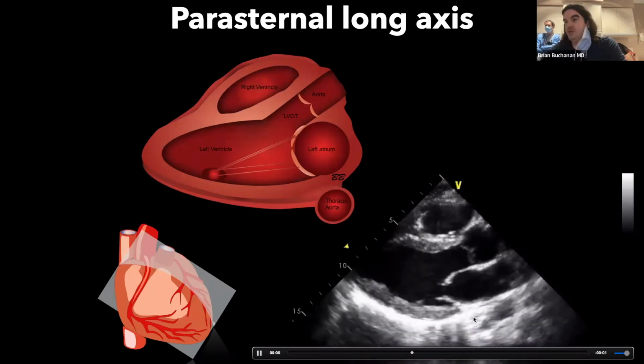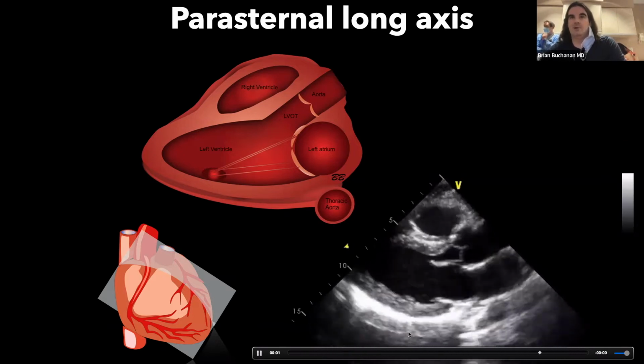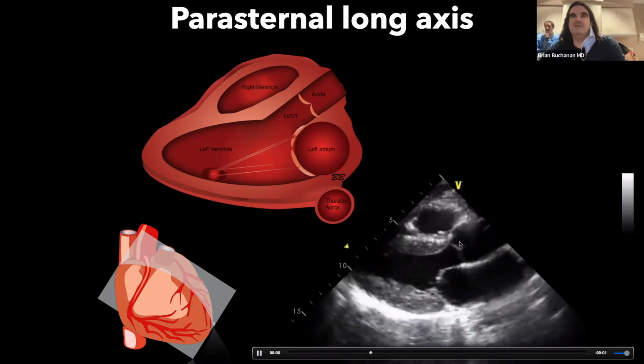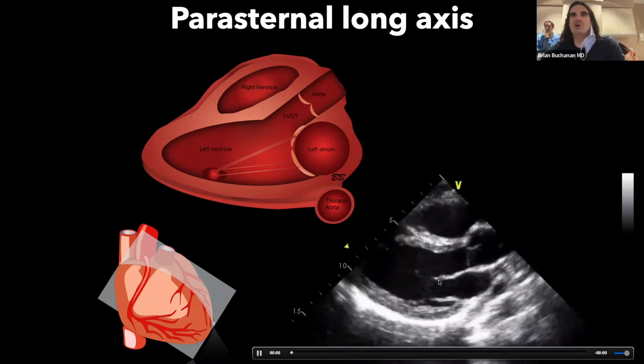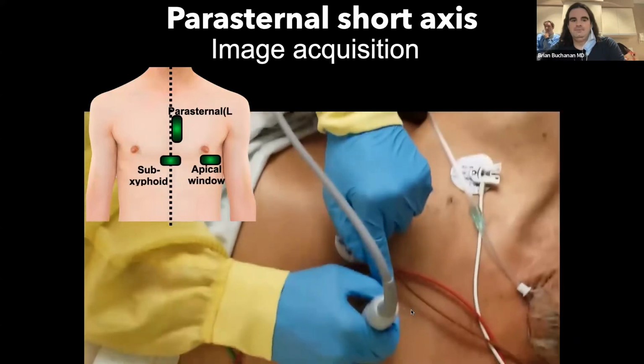And of course the heart's in the left chest. So if you see a collection of fluid back here, say for a pleural effusion, that's a left pleural effusion, because you're in the left chest, obviously. So this is a key view to assess even just some basics in function, looking for pericardial and pleural effusions, but it's such a core view.